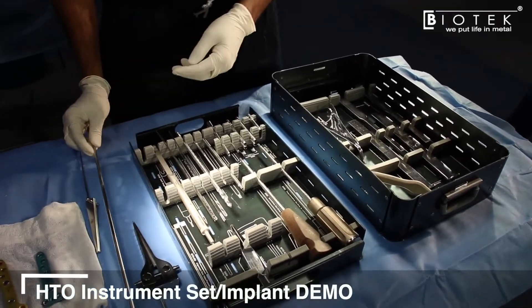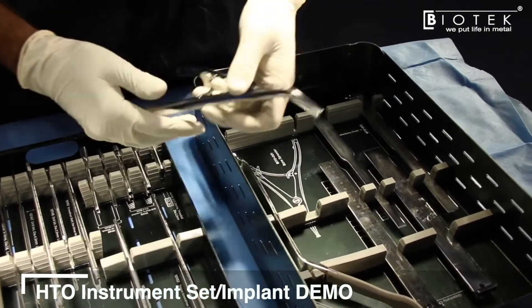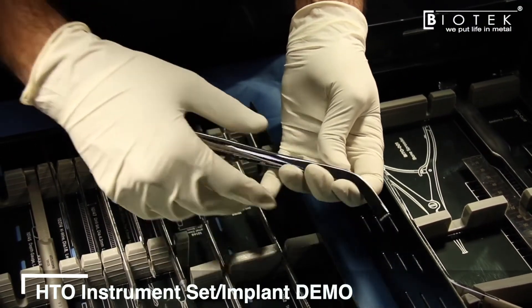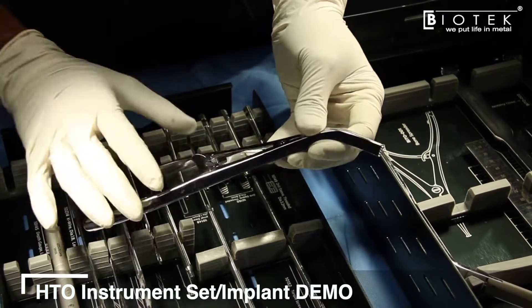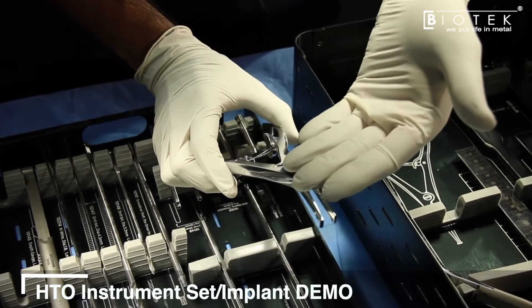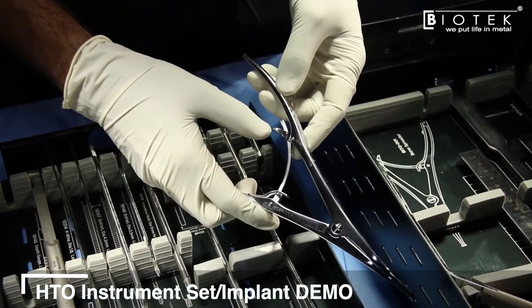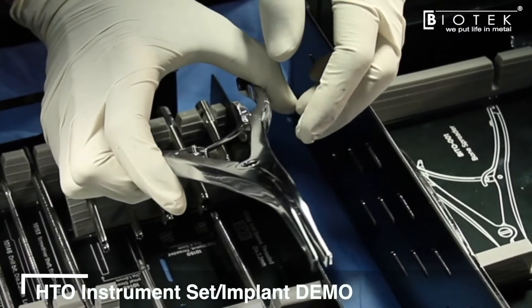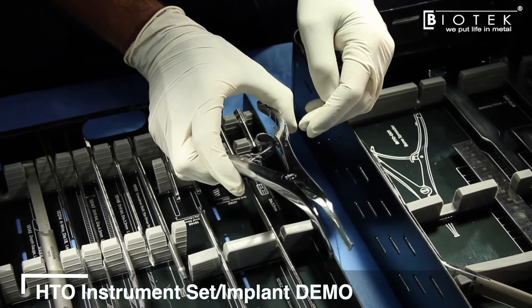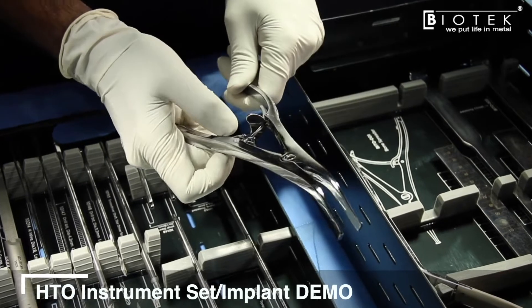Once the desired correction is confirmed, the osteotomy can be held open using the bone spreader, which has serrations at the front and is angled so that when placed posteriorly on the tibial cortex it provides enough space for working anteriorly. It comes with an AO-type ratchet attachment — open to the desired width and lock it in place.